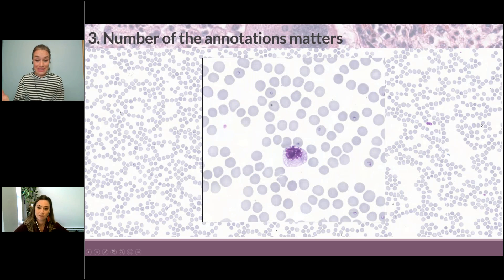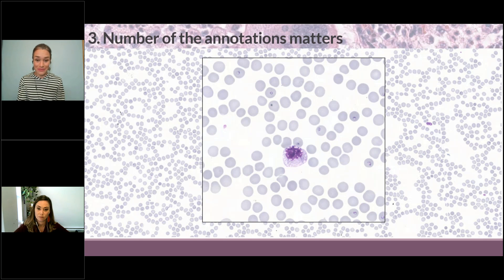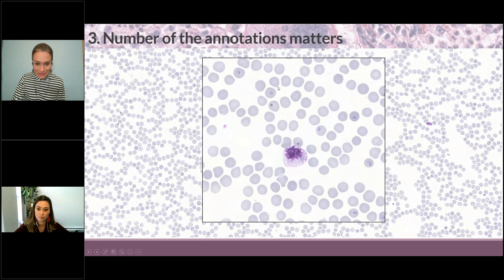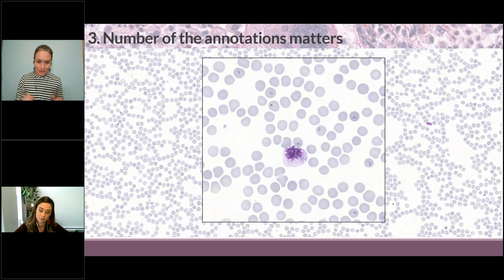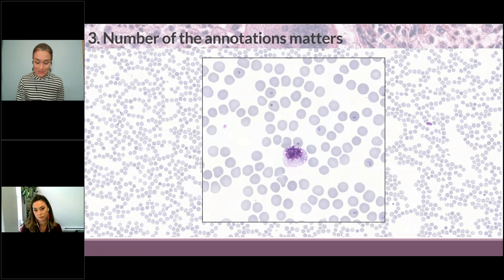So in this case, this is a blood smear from a patient that is infected with malaria. These are plasmodium — those little dots in the red blood cells are plasmodium malaria parasites. So in this case, I would go in and annotate plenty of normal red blood cells, a couple of those infected ones, and even fewer white blood cells because there are fewer of them.